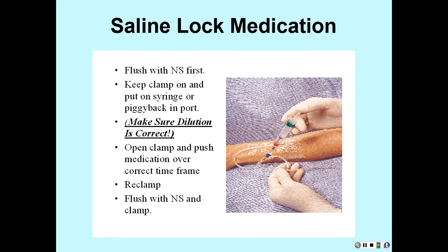Saline lock medications. Along the same lines of when we flushed it. Okay, we go in there, we flush it, make sure it's patent, hook up our medicine, either infuse it at the correct rate or push it at the correct rate.